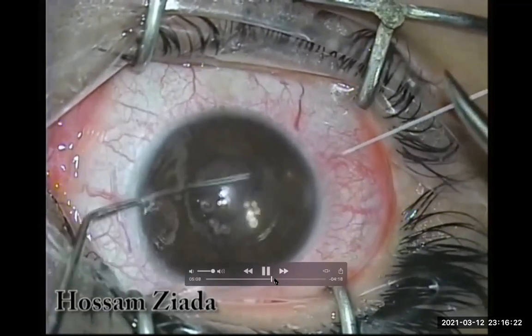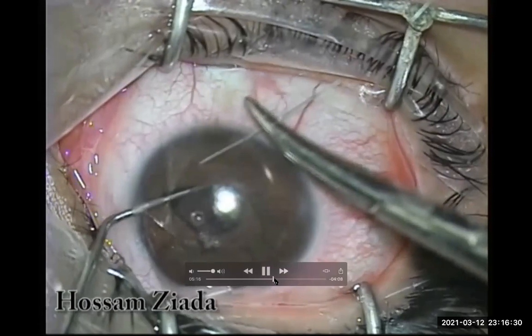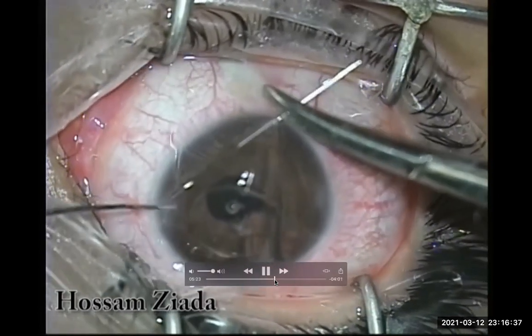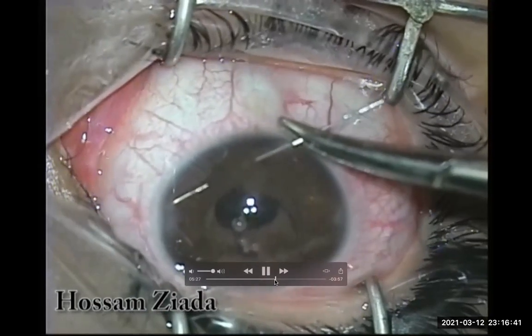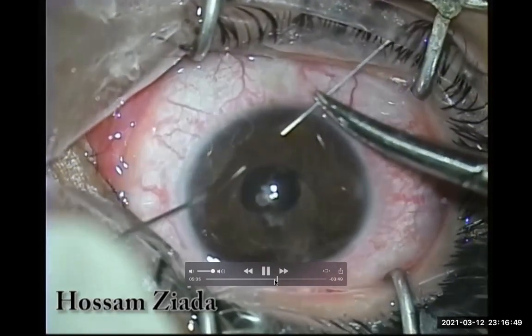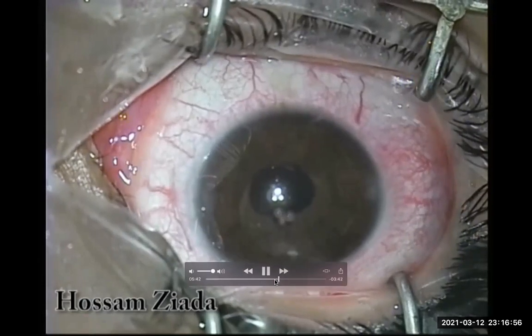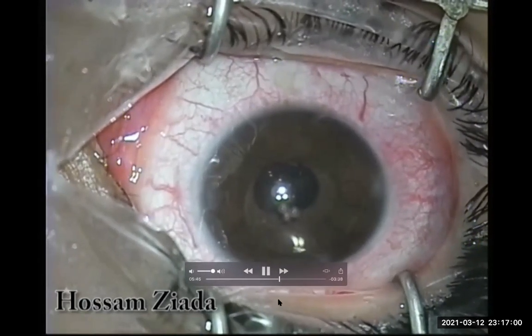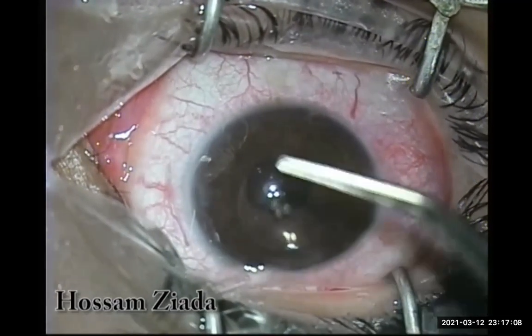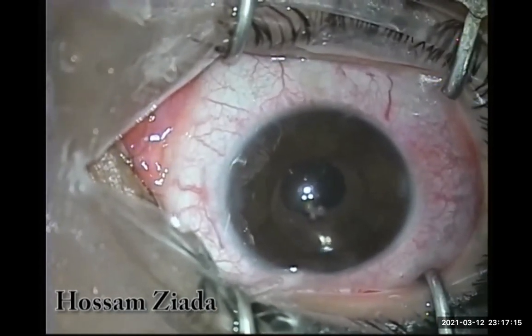The first suture is passing through. I'll push the optic up to identify the site of the haptic, then pass the needle just below it — be careful not to injure the endothelium or the iris. I'll get my free hand on the exit side while on the entry side I'll grasp the suture to make a circle. This is the one-pass technique.